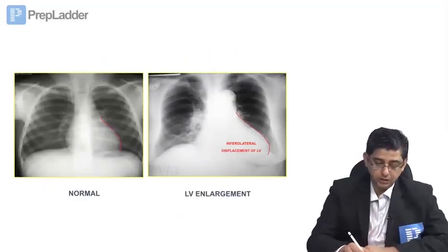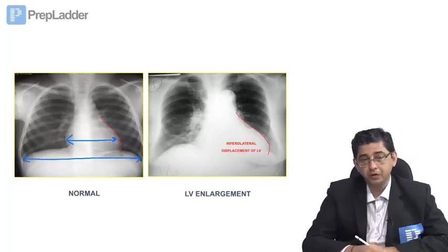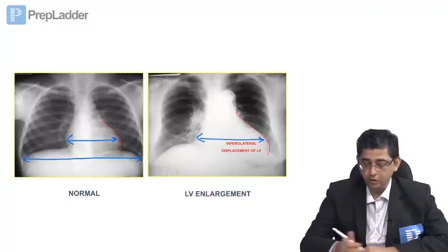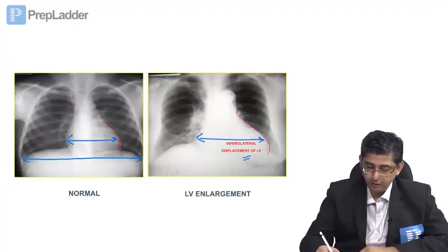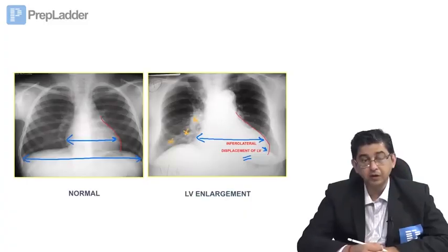Okay guys, as you can see in this particular representation, the cardiothoracic ratio of this patient looks normal. But if you compare with the image on the right hand side, you will notice that the cardiac size is significantly enhanced. You will also notice that there is an inferior displacement of the apex of the heart. You can also notice perihilar infiltrates extending up to the periphery.